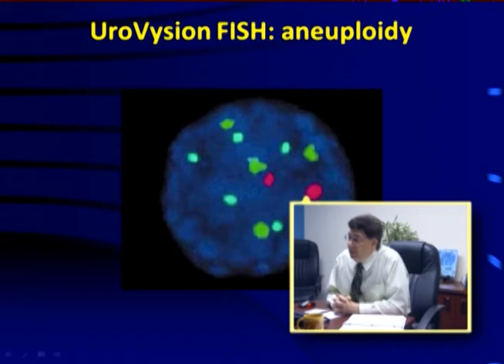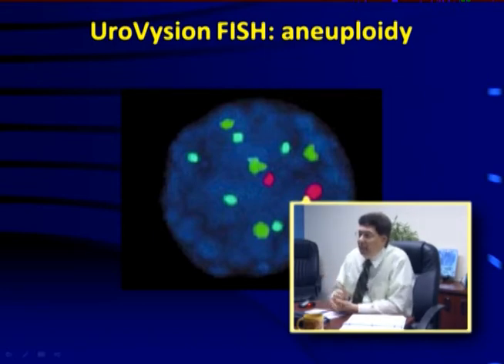And so you might not see all 4 abnormalities in 1 tile or in 1 picture, but you will see some. So even if we get to 25, we need to keep scanning, and we need to scan the entire 12 millimeter circle of cells that we have dropped on that slide.